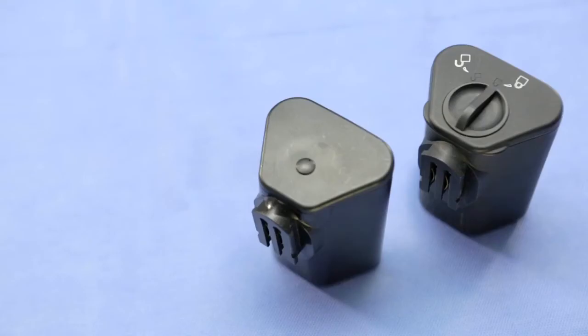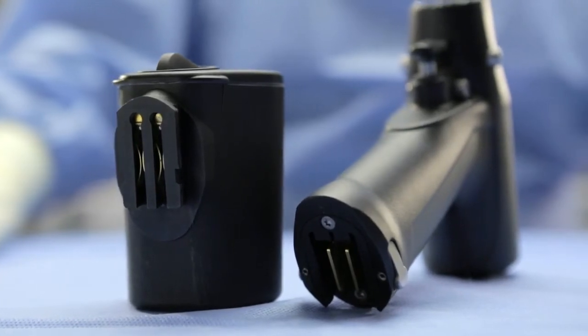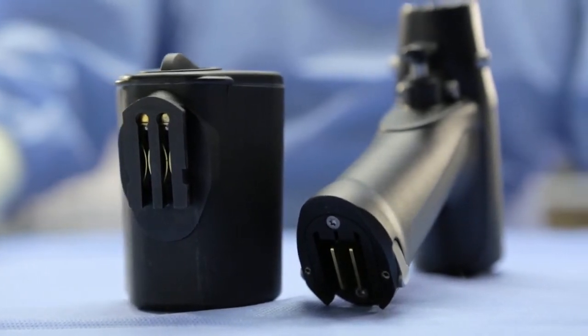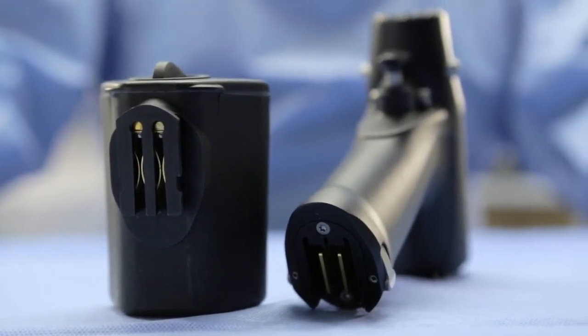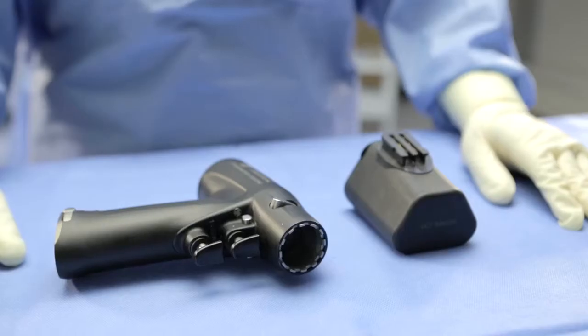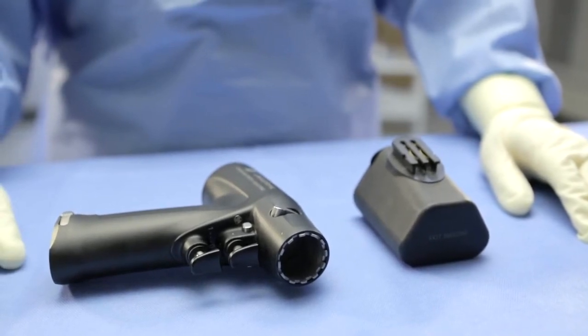Whether using the sterilizable battery or the aseptic battery, the steps to attach the battery to the handpiece are identical. The battery is attached from the back of the handpiece. This was designed so that if a battery is ever not fully attached, the likelihood of the battery falling off the handpiece is minimized. Start by setting the battery on the sterile table with the front of the battery pointing away from you.